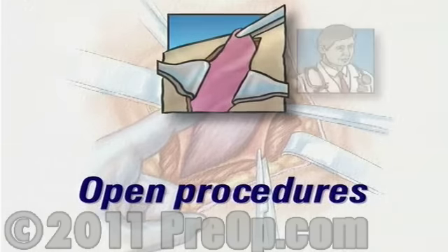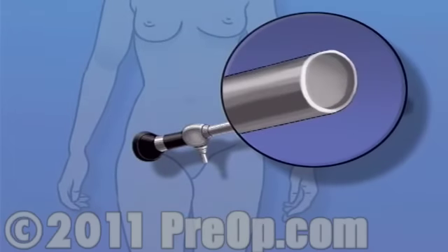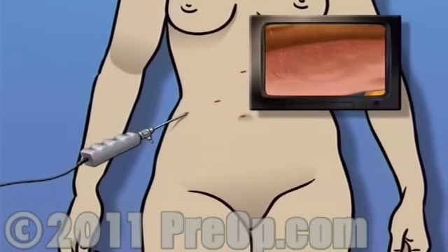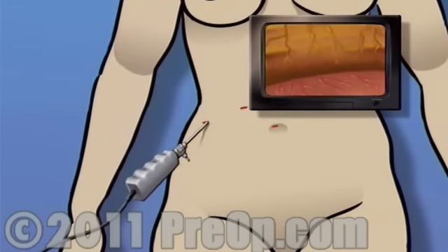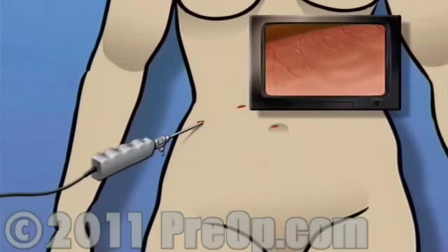Surgical procedures performed by making an incision large enough to expose the entire operative area are called open procedures. Your doctor believes that your medical condition and overall state of health make you a good candidate for a less intrusive laparoscopic surgery. A laparoscope is a narrow tube that contains a light source and a small video camera. Using a laparoscope, the surgeon is able to operate by making one or more very small incisions through which the sterile laparoscope and possibly other instruments are inserted into the body. Using the laparoscope's video camera, the surgeon is able to explore and inspect the interior of the abdomen, often allowing the surgeon to see with greater detail and with more clarity than with the human eye alone.